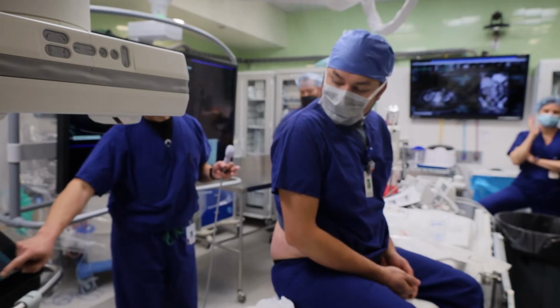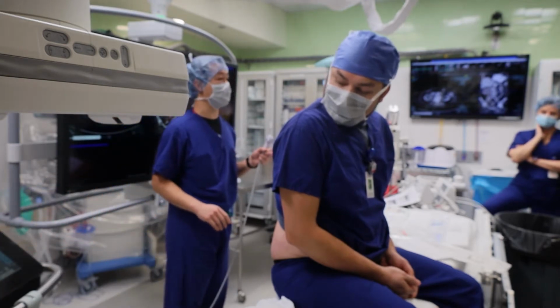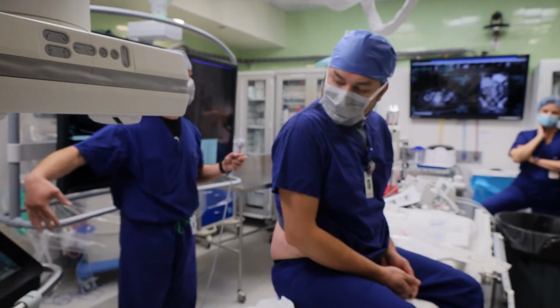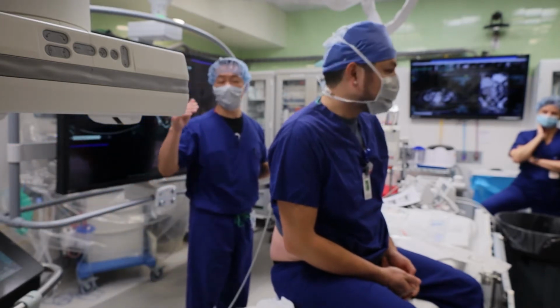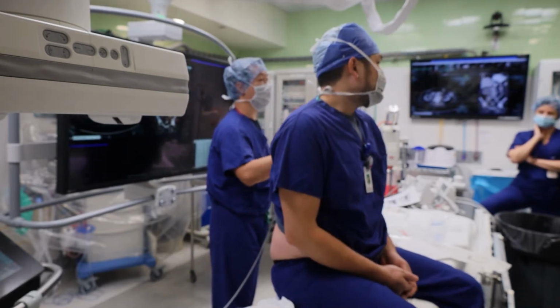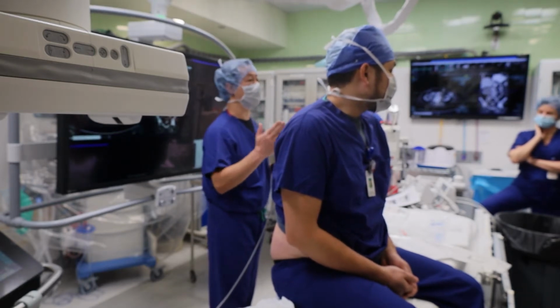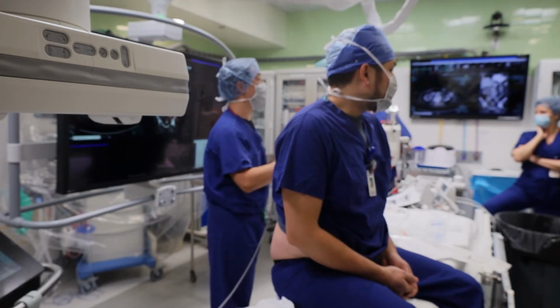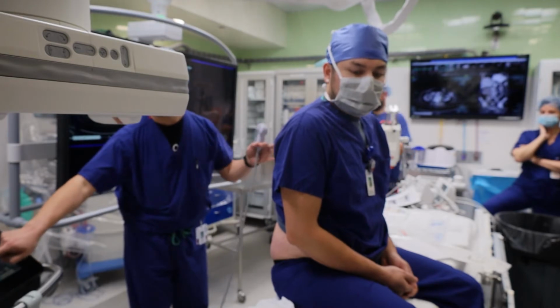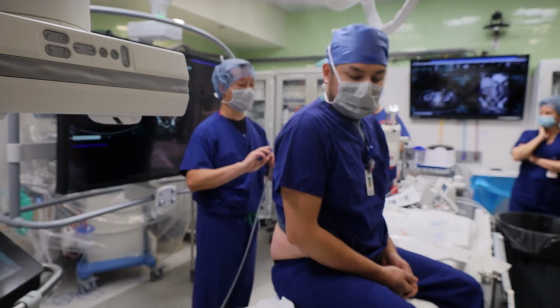But when you look at deep objects, there's something called time gain compensation, TGC, on other machines. Some ultrasound machines have like 8 different levers in a bunch of rows. As the sound waves go deeper and deeper into the body, the loss of energy makes the image darker and darker, and soon you can't see. What it's doing is amplifying the signal from the farther points of the body to even out the loss of signal. So in somebody who's larger, which obviously doesn't apply to him, sometimes we move the lower ones a little bit brighter just to get a better picture.